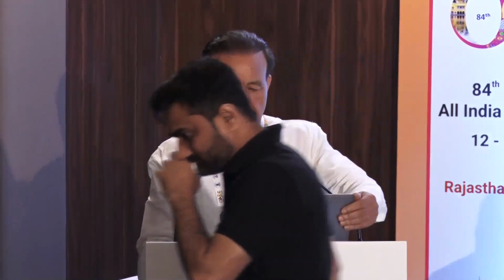Thank you very much, Dr. Alkesh, for inviting me here to talk on this particular topic. I'm going to talk on the failed chop, troubleshooting the failed chop.